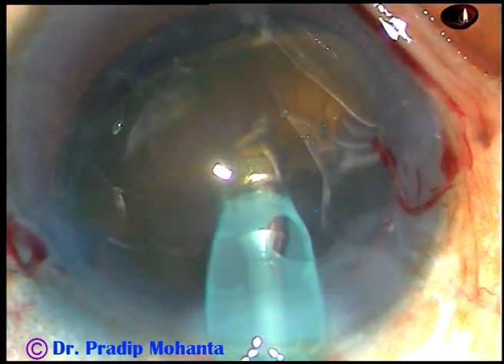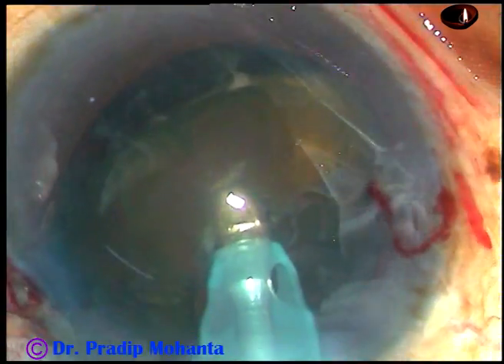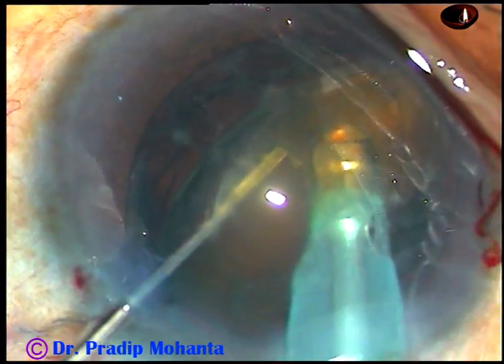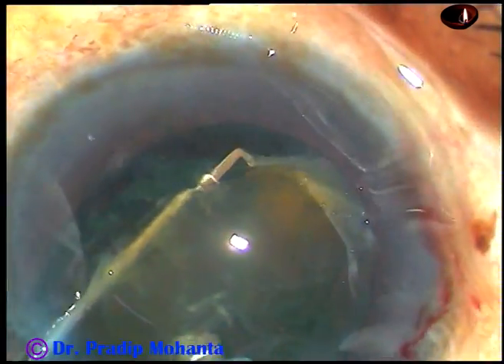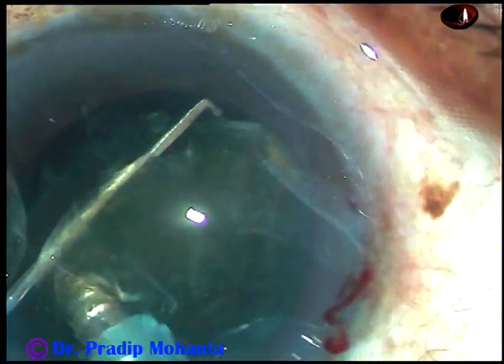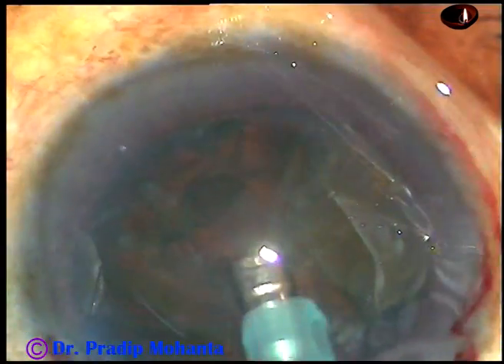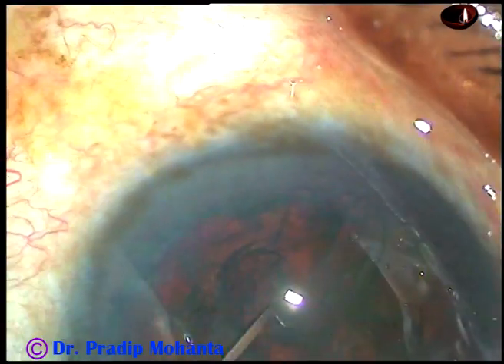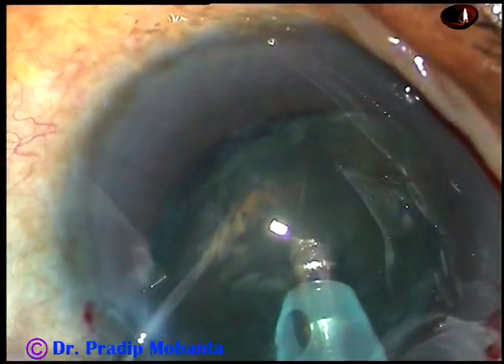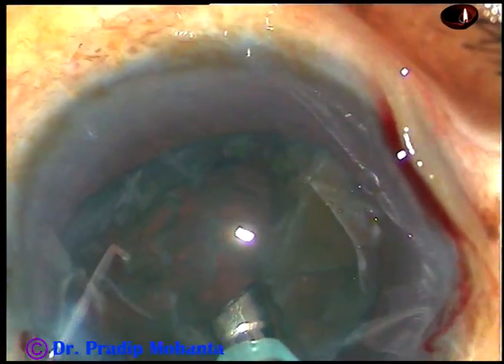The chopper goes to the posterior surface of this tilted nucleus and supports this nucleus. And now, I am making two, three cuts and this tilted portion is made free and it is emulsified. And now, the nucleus is held at a deeper plane and some more nuclear mass is emulsified and removed.